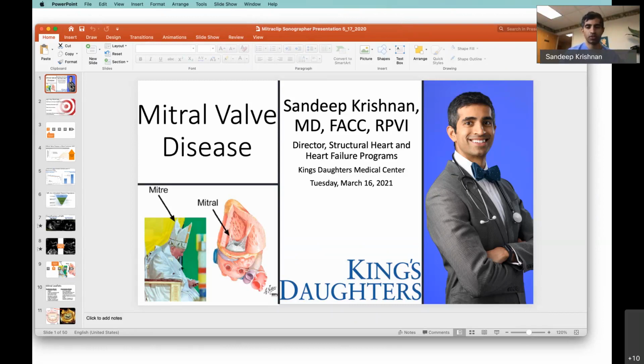Okay, so I want to keep this fun and interactive, and just yell out if you guys have any questions or you want me to stop. But this is going to focus on mitral valve disease and imaging, and I wanted to put some slides in here for aortic valve disease.